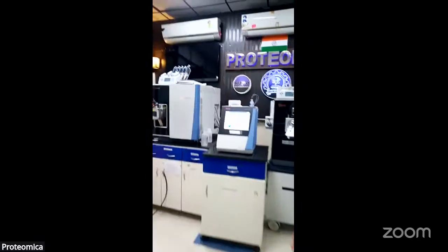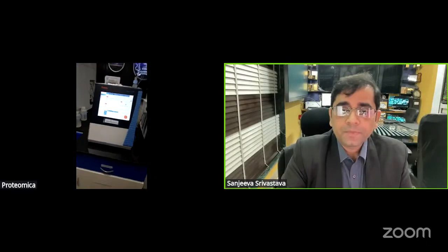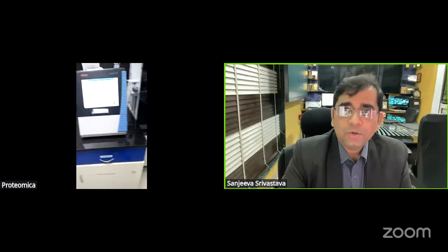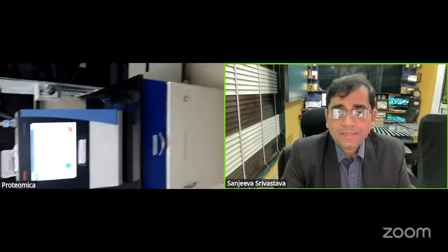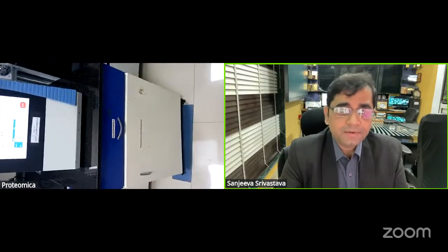First, we are starting with the timsTOF. All right. So sample prep could be very tricky, and you have to really understand your biochemistry very well, because when you see different types of sample, you have to try different ways of lysis or different types of solubilization. There cannot be just one single method of doing the sample preparation. But what we just showed you is the flavor of the general steps involved: how to make lysate, how to quantify that, how to look at qualitative changes and look at the gel profile. Those are very basic but very important. And then you are going to digest that protein and get sufficient peptides.